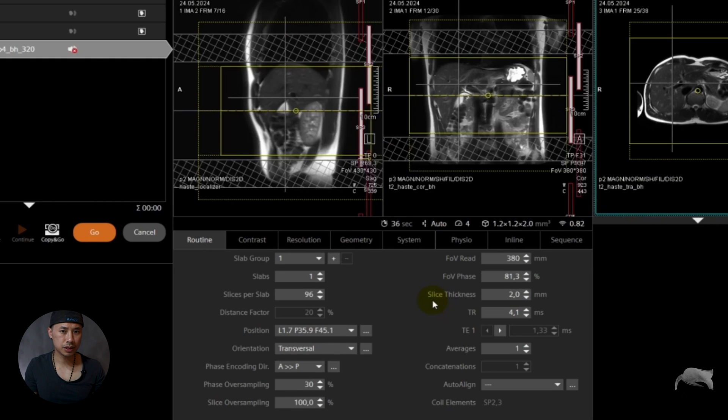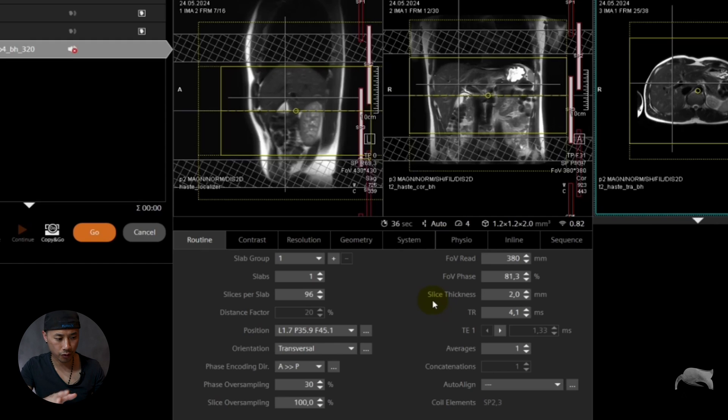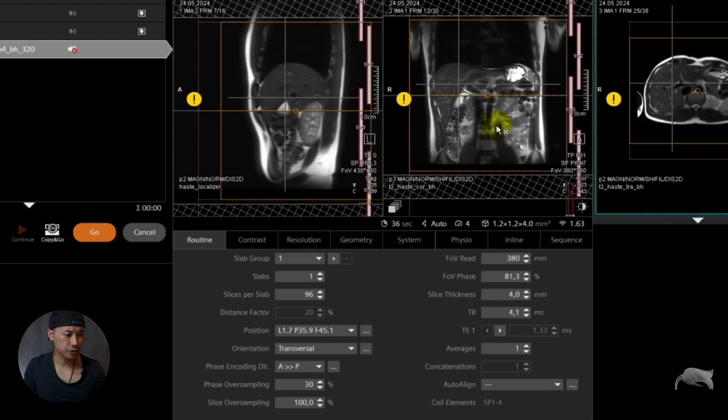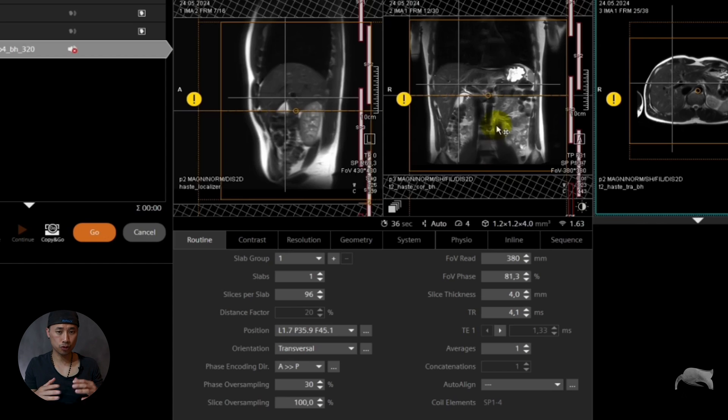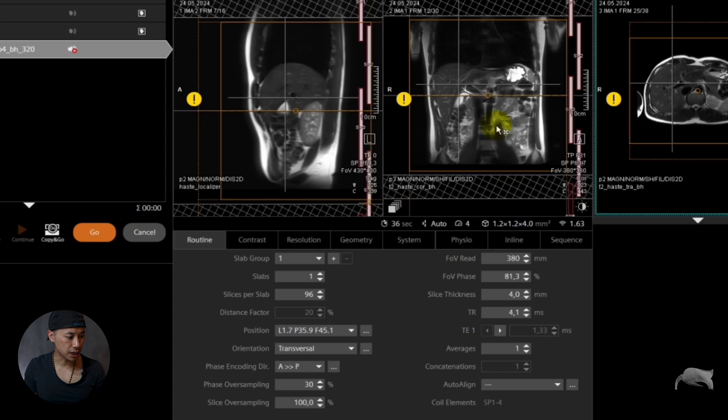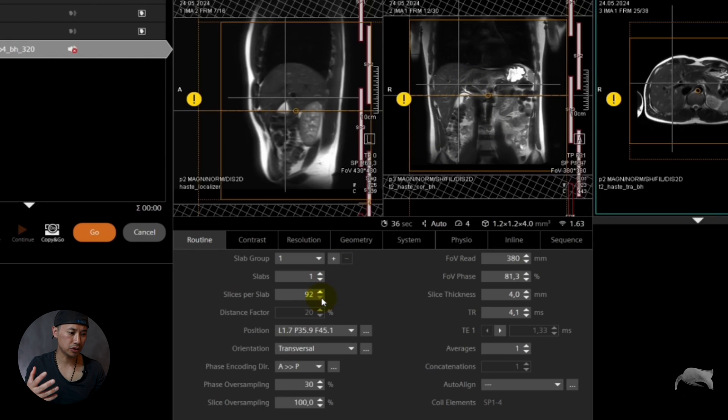So let's now do something a little bit crazy. We go from 2 millimeter to 4. Let's see what happens. So we choose 4 and you see now with 96 slices is too much, we don't need to cover that much. So what you do now is you cut the slices and then you can see you're able to save scan time as well.